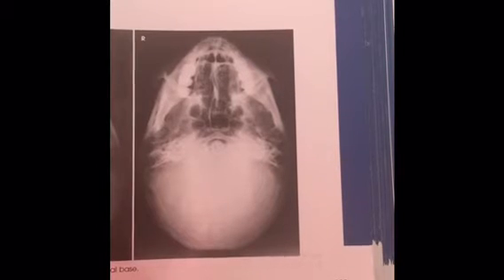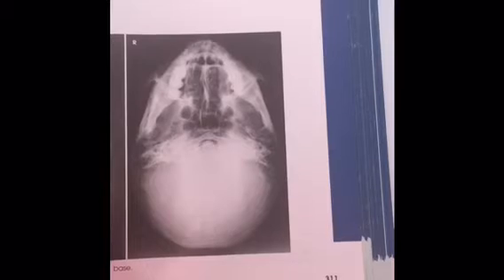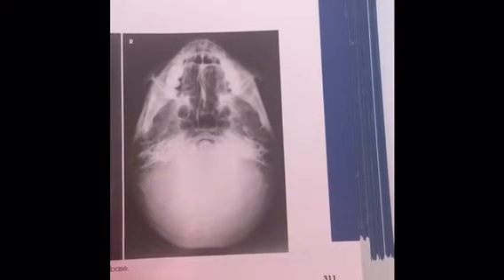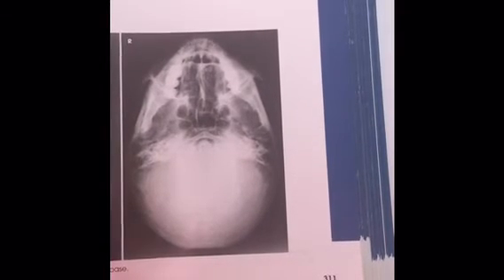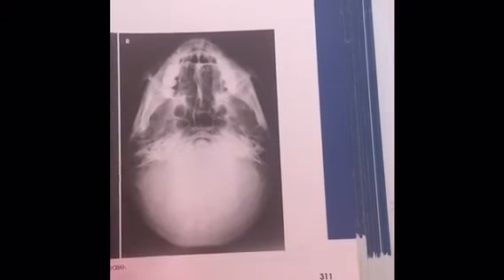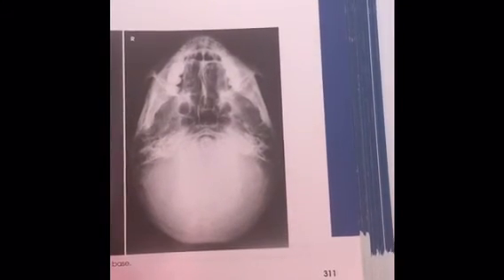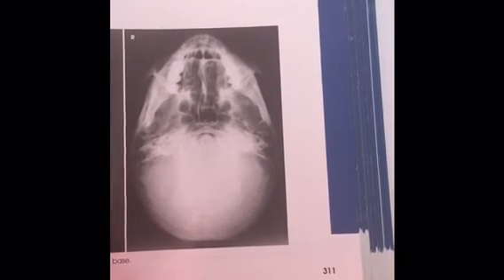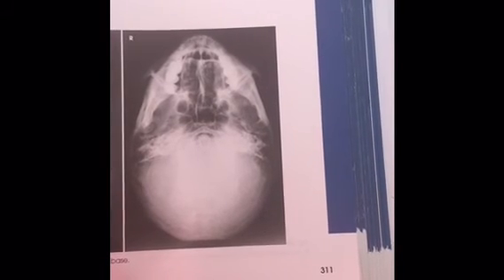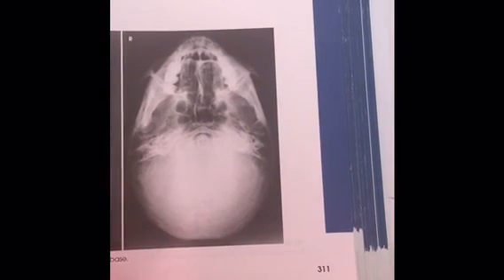This is our SMV Schuller method projection of the skull. The evaluation criteria is evidence of proper collimation, entire cranium without rotation or tilt demonstrated by equal distances from the lateral borders of the skull to the mandibular condyles on both sides, symmetric petrosae. The IOML is parallel to the IR, demonstrated by mental protuberance superimposed over anterior frontal bone, and the mandibular condyles anterior to the petrosae, and the brightness and contrast sufficient to demonstrate cranial bone anatomy.